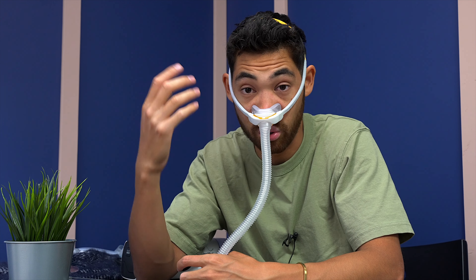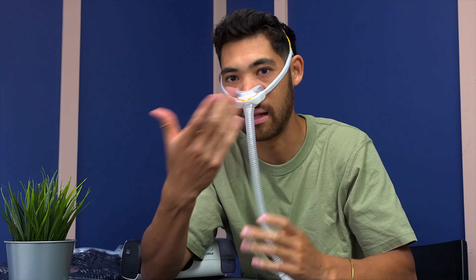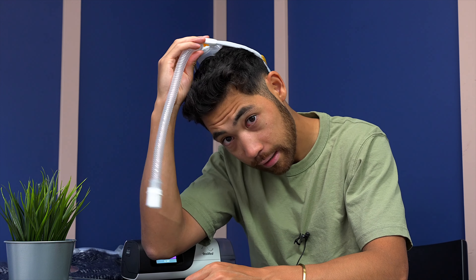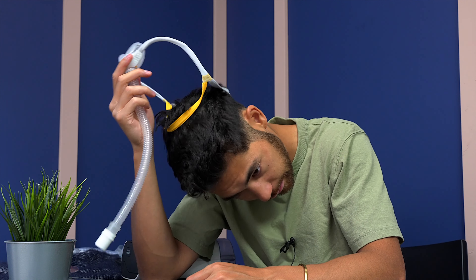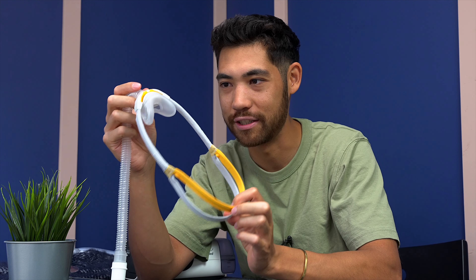You push it up and it locks in place — it's insane how it works. It locks in place, it's sturdy. To take it off, you just pull it. If you push it in, it locks so that a pillow or nothing is going to move it. If it does shift, you just tap it and it locks back in place. So because of the one-hand nature of the Solo, it's definitely the better headgear. I think it's a marvel of CPAP headgear engineering.